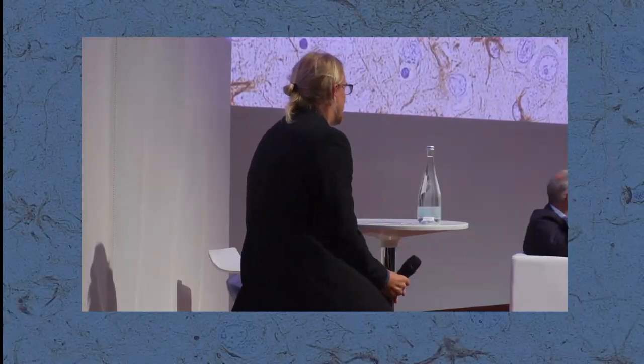Yes, absolutely, and that's exactly the plan. We collaborate with the University of Amsterdam, and they have amazing technical expertise. They co-register all the 700 or 800 slides back together to make it one brain again, and register that to the neuroimaging, first to the ex vivo, so you have a 3D rendering of neuroimaging and neuropathology together.